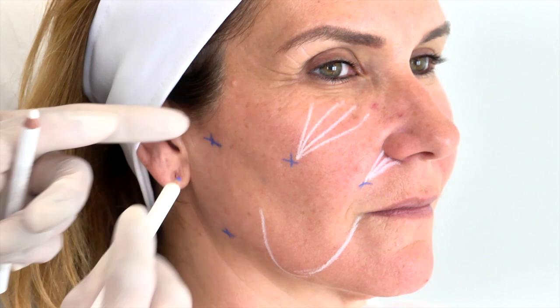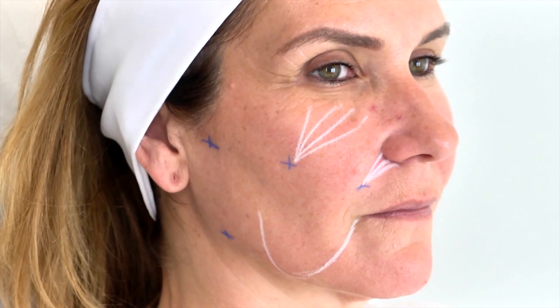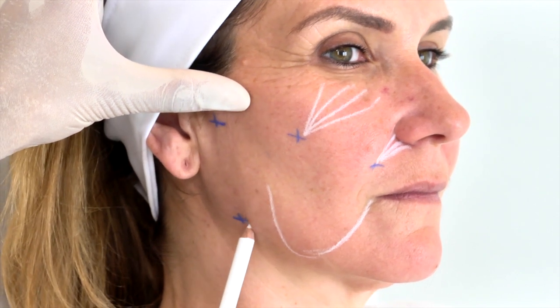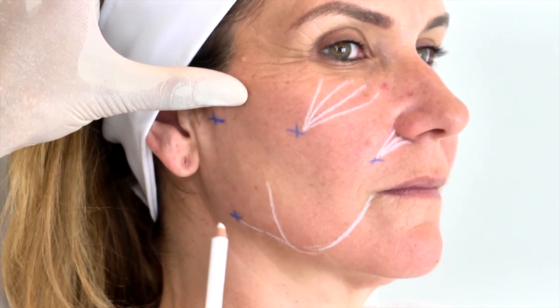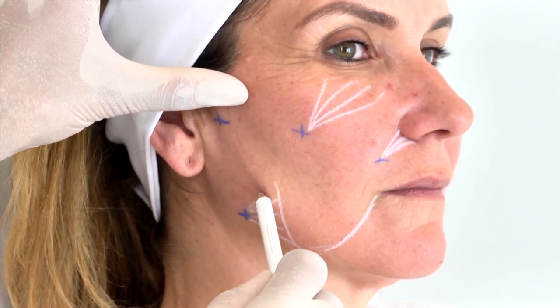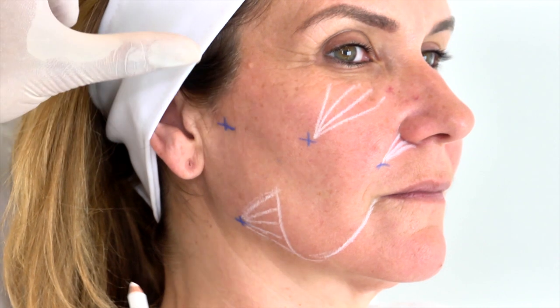The cannula or needle is inserted at the mandibular angle or slightly forward of it if there is a lot of cutaneous laxity. Correcting the posterior segment of the oval is done along the length of the posterior notch, from the mandibular angle to the lower part of the jowl without exceeding its limits in order not to weigh it down. The notch is essentially filled opposite to the inferior face of the mandibular bone, using a tight fanning technique that succinctly rises up the lateral face of the bone to restore the mandibular angle.